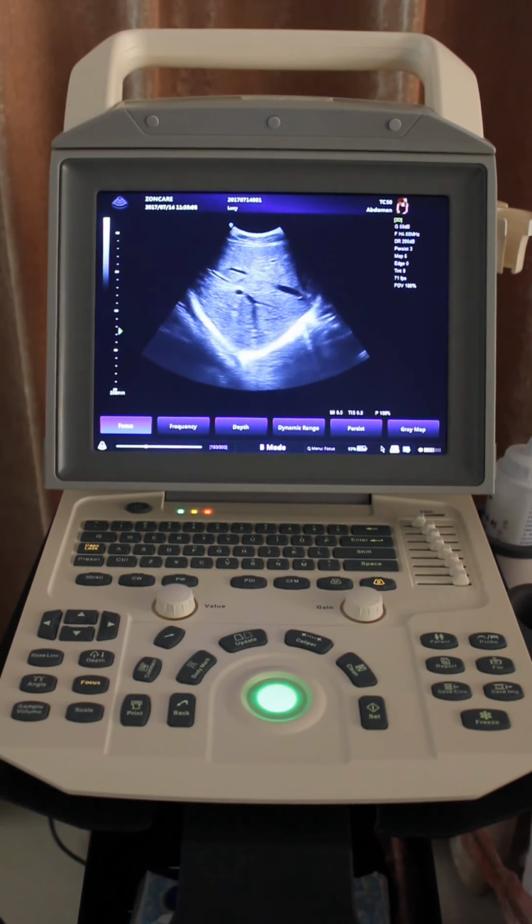Okay, just now we had already finished the B mode parameter introductions and how to adjust B mode parameters. So let's come to the M mode. M mode is always used in cardiac. So for the parameter adjustment, it's nearly the same as the B mode. We can see there are the same important parameters here. We can use two methods to adjust the parameters.